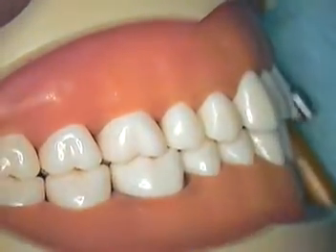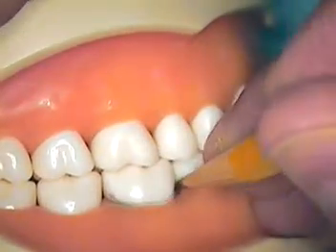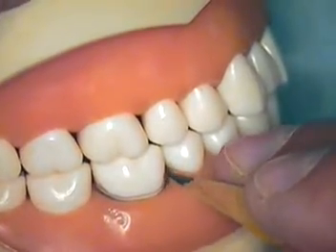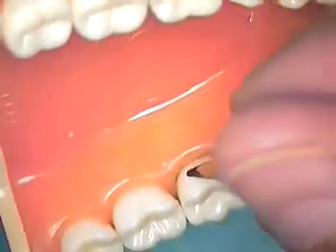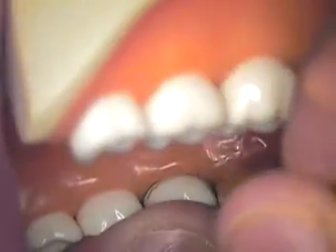As I discussed in class, what we want to do first is draw a line right at the gingival line, going all the way around the tooth. Take your pencil and just mark that, because our margin is going to be just about at the crest of the tissue — we don't want it to go below so that we can record it. Make sure it's above the gum line. You might have to redraw this because it's pencil and pencil will wear off.